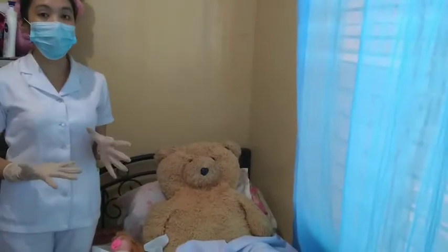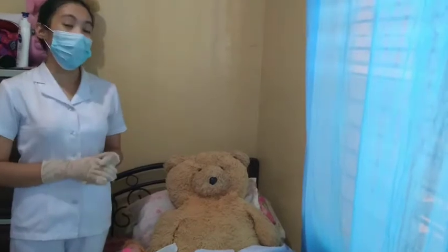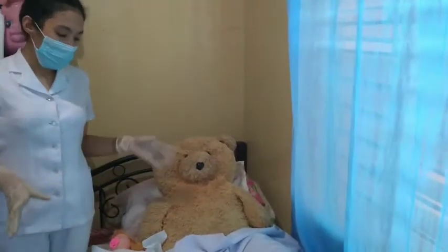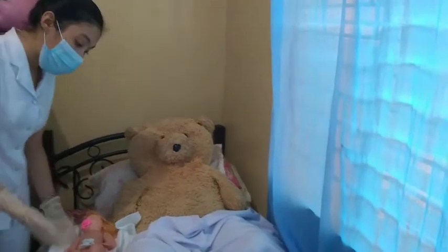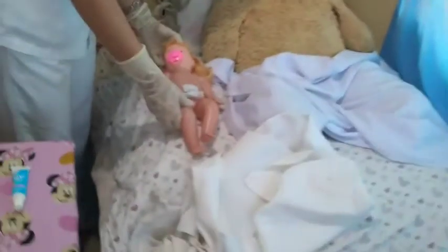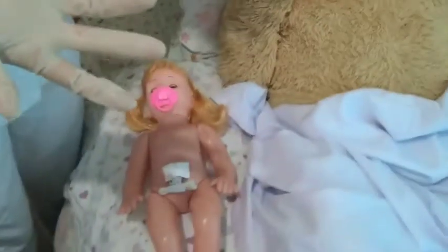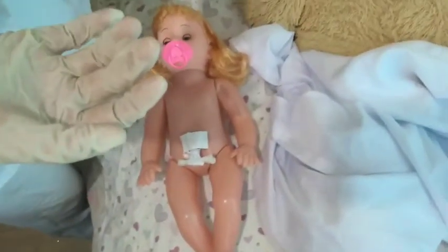Next, we check the weight of the baby. We make sure the weighing scale is warm and not cold, and we remove all linens covering the baby for an accurate measurement. The normal weight range for a newborn is 2.5 kilograms to 3.5 kilograms, or 5.5 pounds to 7.5 pounds.